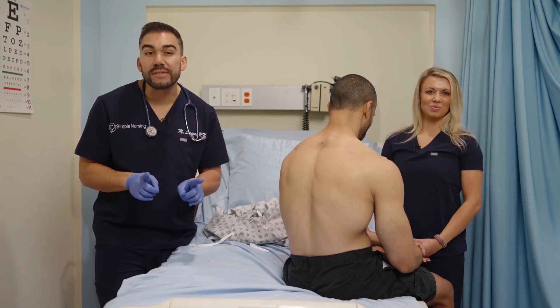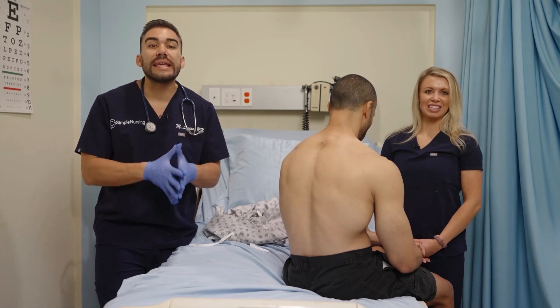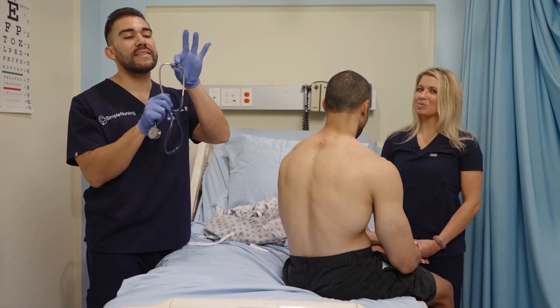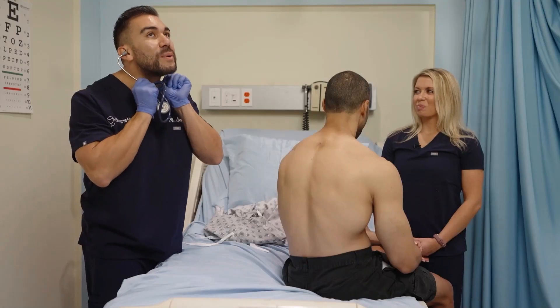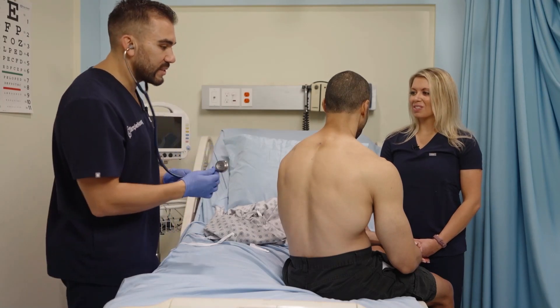Normal breath sounds — you are hearing that air open and close in the alveoli, so we want that good air exchange. Keep the basics correct: we want the ear tips to be pointed the right way to go into the ear. You'll see it a lot in movies where they go the opposite way and it doesn't work. So put it into the ear, and Allison, how are we doing this assessment?